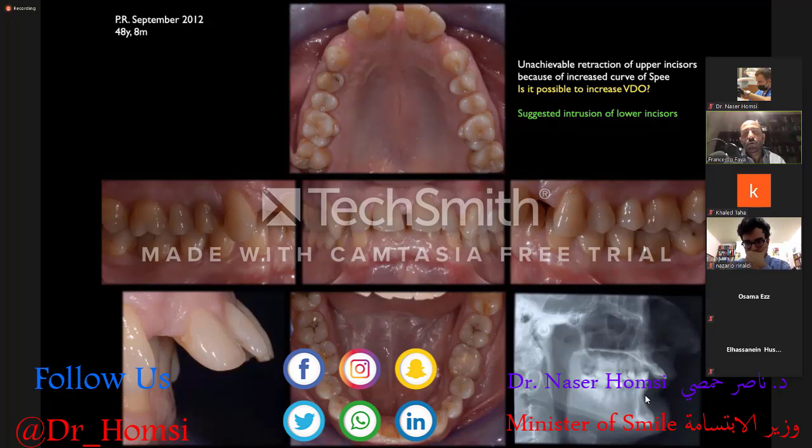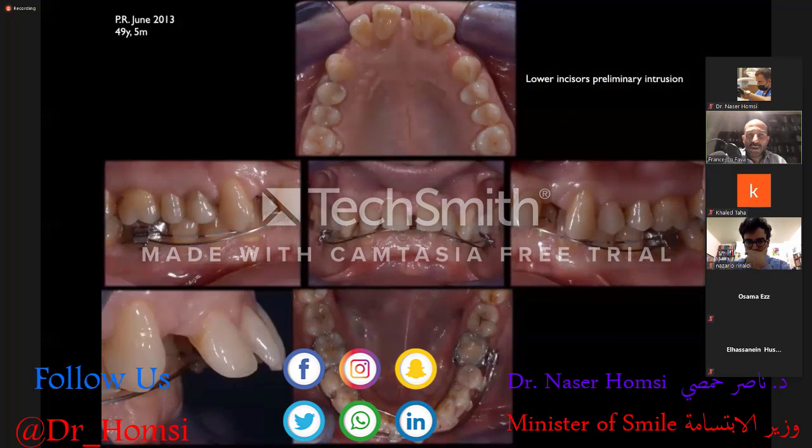We know that to obtain a pure intrusion of the lower incisors is quite hard with a continuous arch wire, for two reasons. First, the intrusion forces act buccal to the center of resistance of the lower incisors, and this creates a tendency for the incisors to flare. The second reason is that working with a continuous arch wire, it is very hard to create the exact, very light amount of force indicated for a pure incisor intrusion. This is the reason why we decided to use, in this case, the Segmentary Technique in order to obtain a preliminary intrusion of the lower incisors.